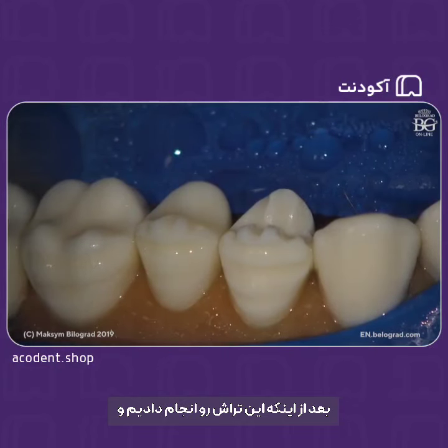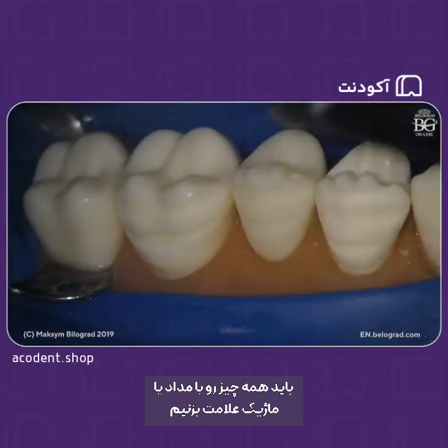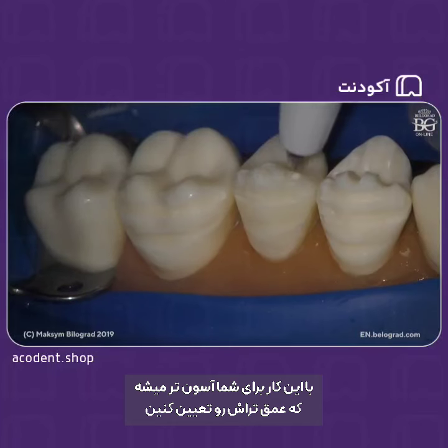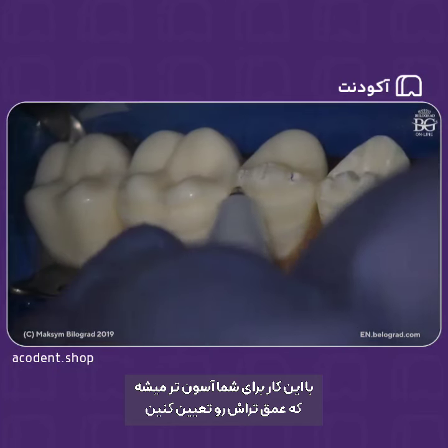coverage. Once you make this type of preparation, you made these grooves, we have to mark everything with a pencil or with a marker. We have to mark these grooves, these lines. It will be easier for you to determine the depth of preparation.